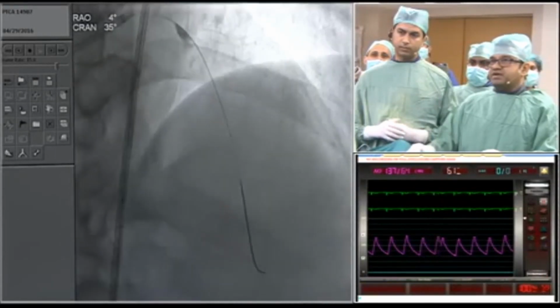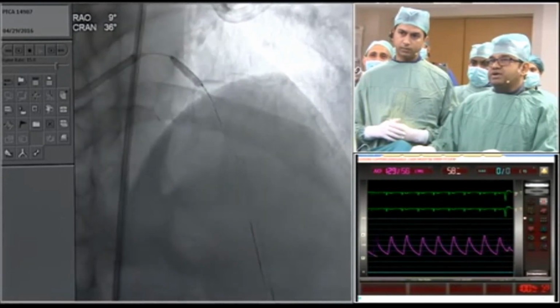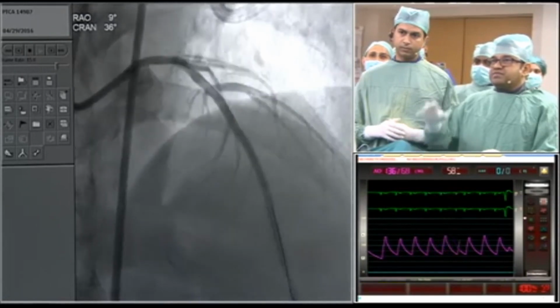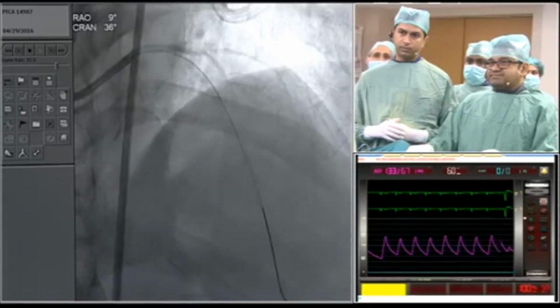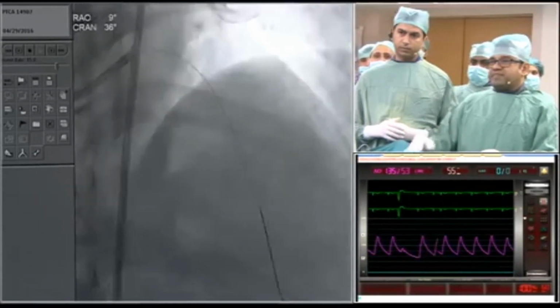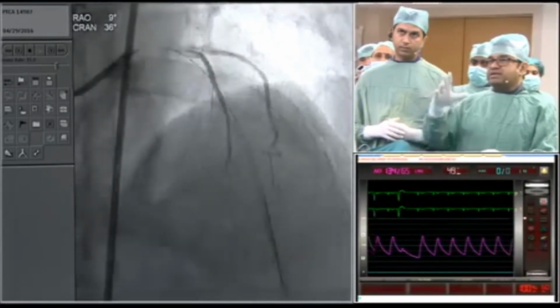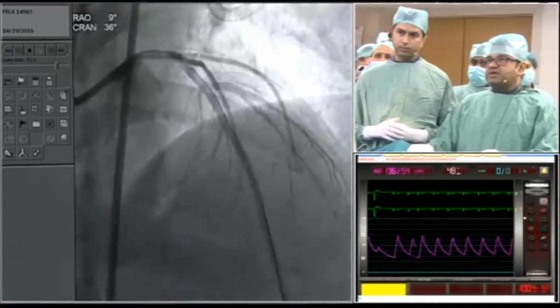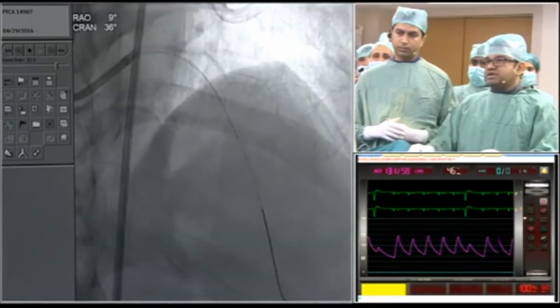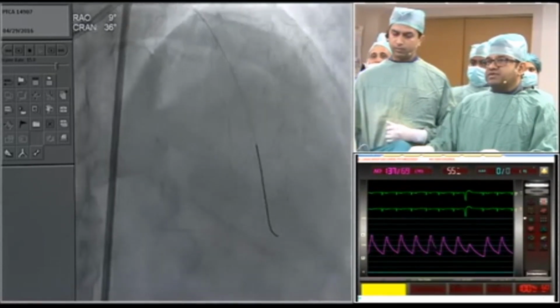So next, we have just done a balloon dilatation with a 2.5 by 12 millimeter balloon at 10 atmospheres. Next slide. So you could see this is the place where we are. It was effective because it restored flow. So this had restored the flow, but you can see that the LAD was quite a big artery, and there is some spasm in the proximal part of the left main. You could see if you compare the LAD to the left main, the left main looks a little spasmodic, and the LAD looks almost a 3.5 to 4 millimeter size vessel.